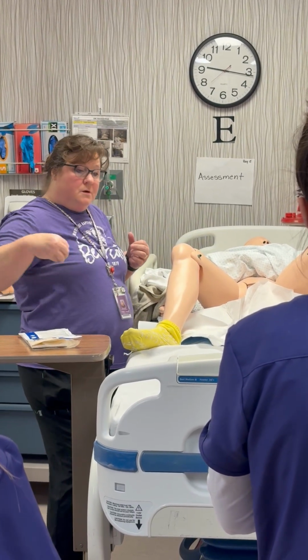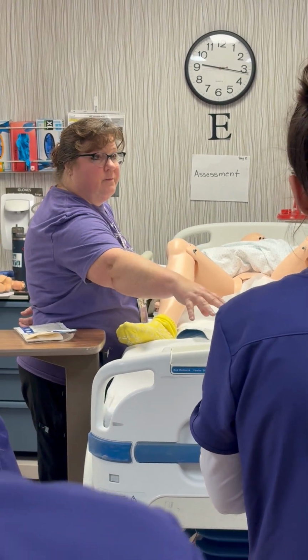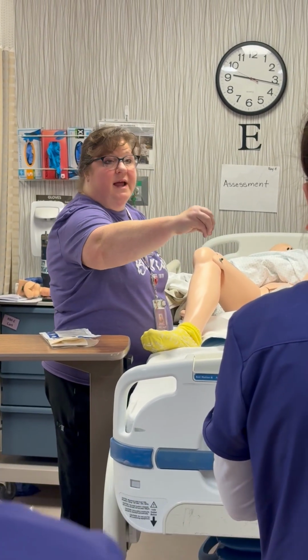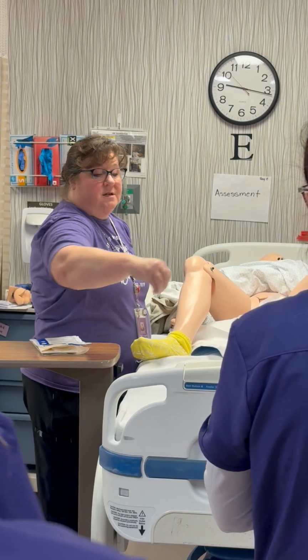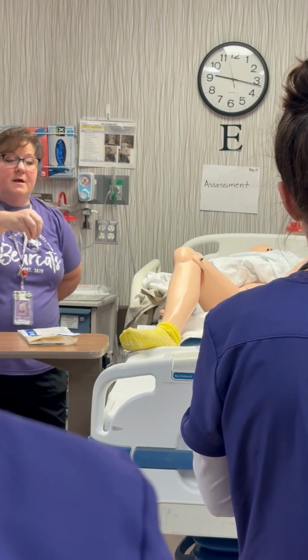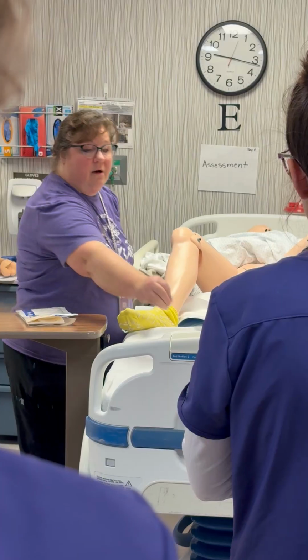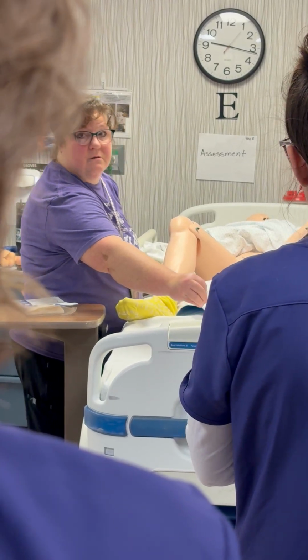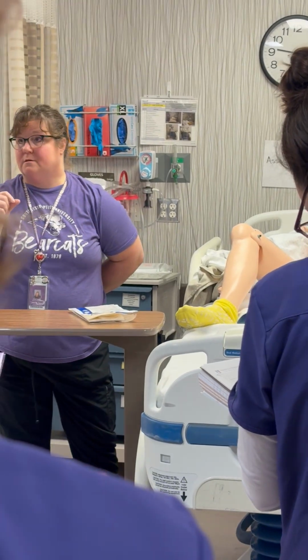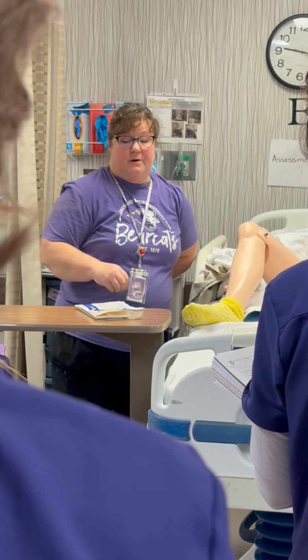So out and around. So when I'm here, is this sterile? No. So I have to keep my hands that are clean above that, especially when I start having my sterile gloves on. So it has to be 6 inches above that dirty, okay? So most people forget that part, they do this, okay? So now you're below your 6 inches, okay? Remember I said, we watch all of those little things for sterile field, okay? So make sure you're how far? 6 inches, okay?